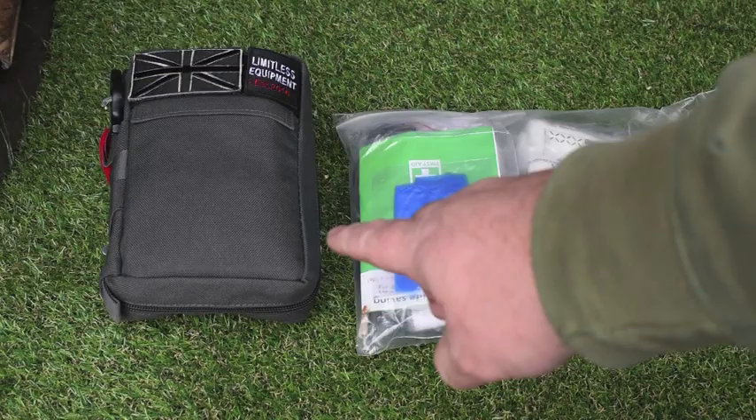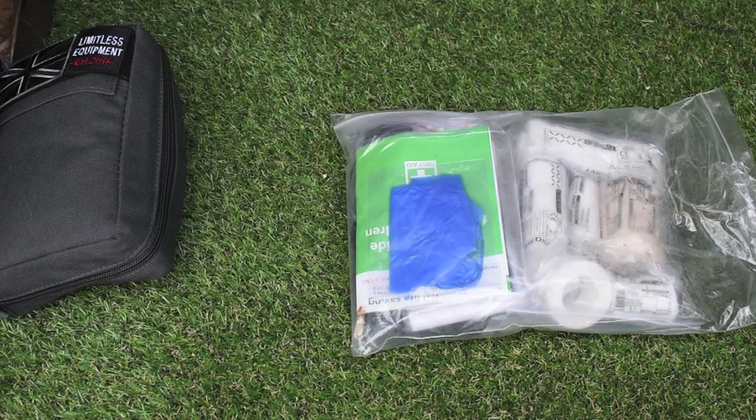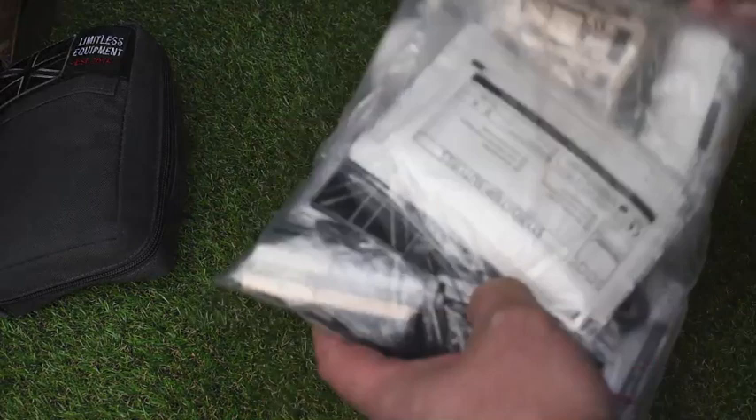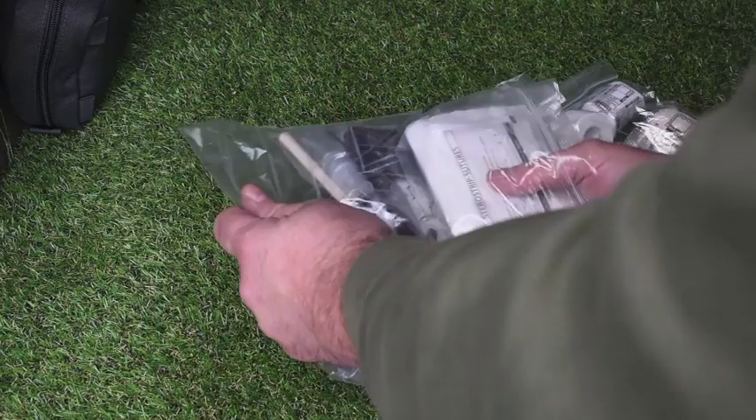Here we have the Alpha First Aid Kit that I've done an overview on — that's it complete with the pouch. Brilliant kit for the price, coming in at £35. We're going to take a look at the refill. The refill comes as is. On the site it's on sale at £19, and you can pick it up on Amazon for around £25. So let's take a closer look at what's actually in this pack.